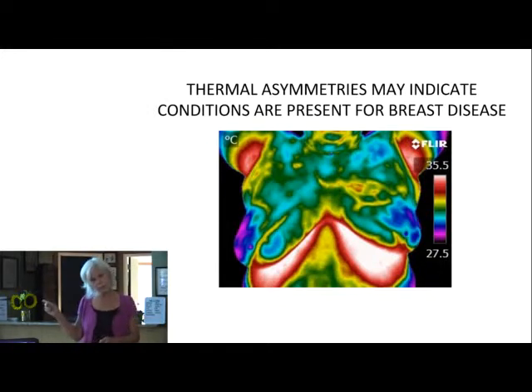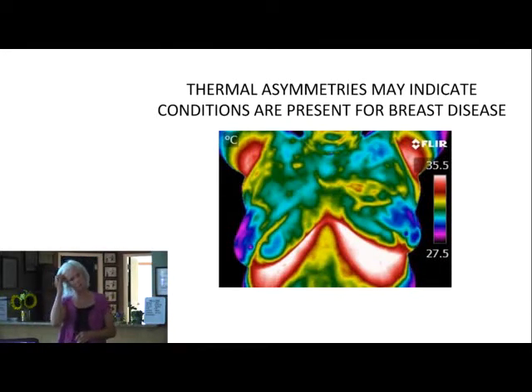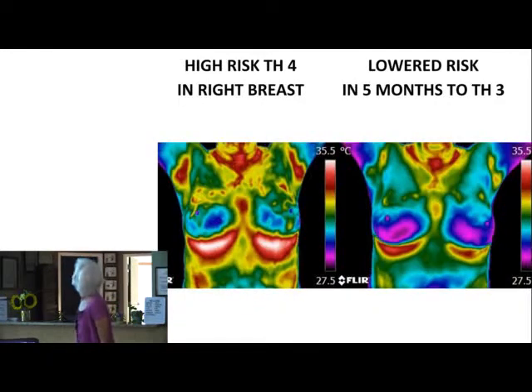So what this means for this woman is if she doesn't take charge of this and make some changes, and we'll talk about all the things you can do, positive things you can do, then there's a very good likelihood that she'll have breast cancer again if she doesn't take action, take charge of this. So that's what asymmetry looks like, and you're going to be seeing some more images that indicate asymmetry. Okay, next, Effie. All right.